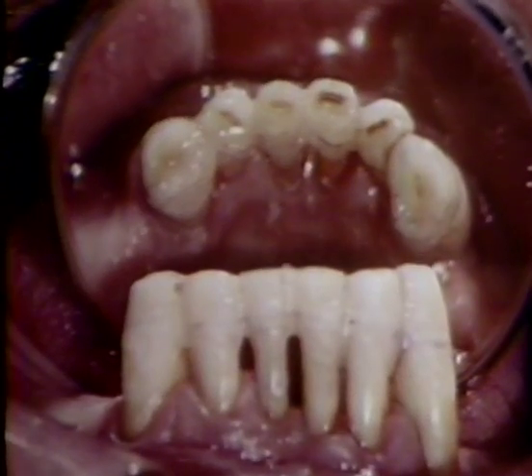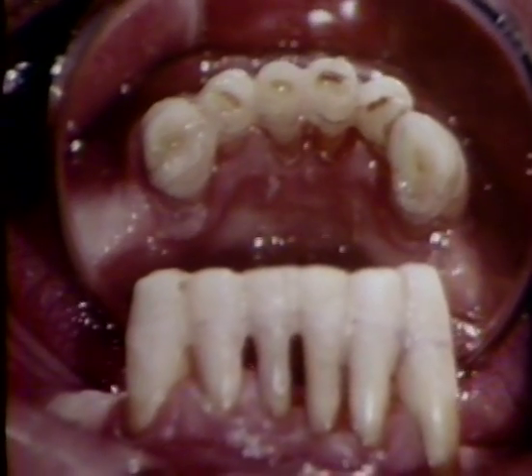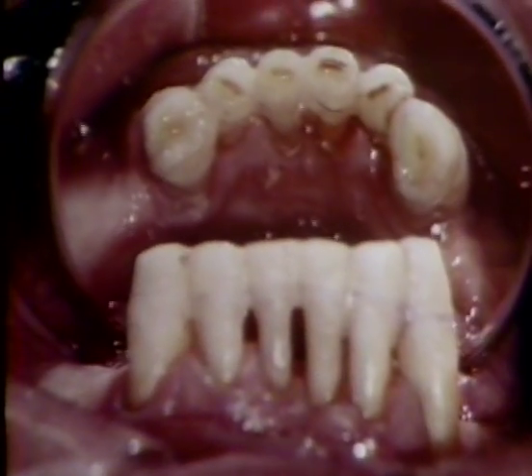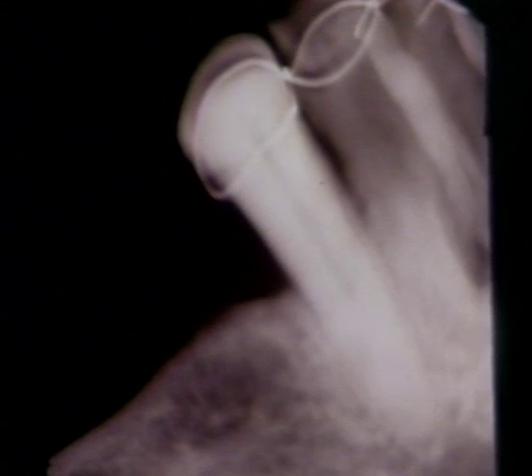These intracoronal splints should not be left in position for more than 6 months without careful checking for the occurrence of caries. Postoperative radiographs show the condition of these teeth immediately after stabilization.